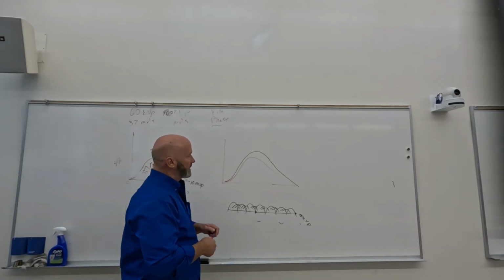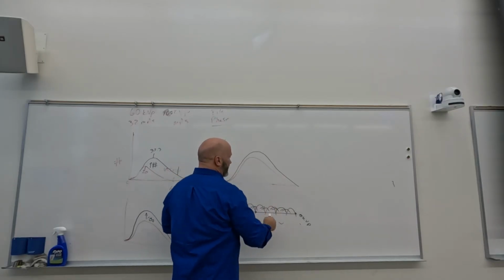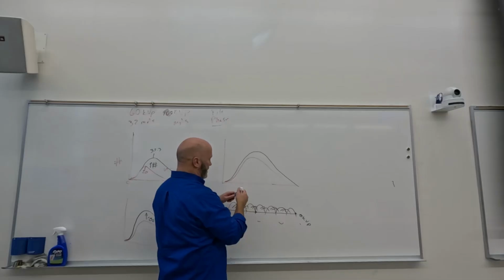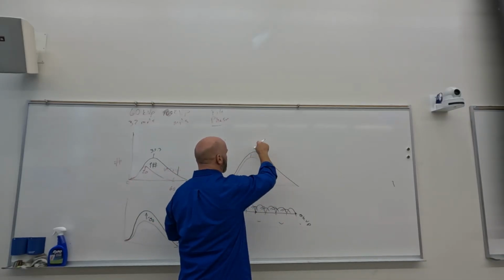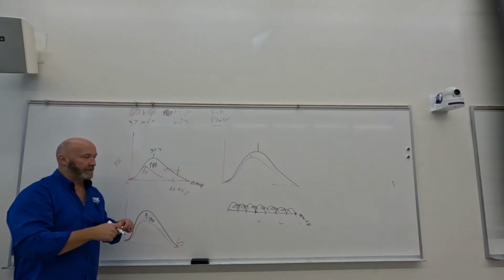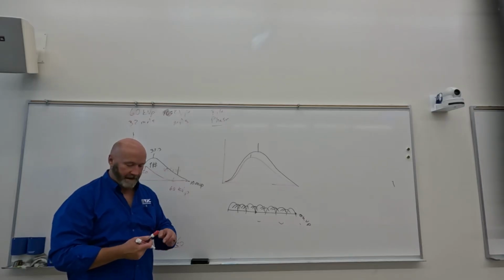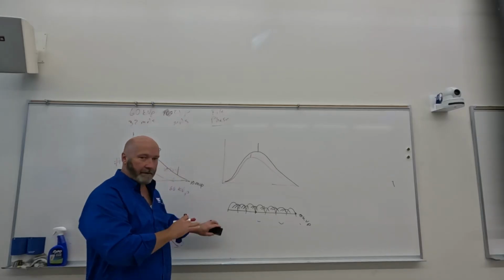And so how that translates here is that once we go from single phase to 3 phase, our peak remains the same, our minimum remains the same. We get a doubling of the numbers, but if you notice, we've got a slight change in the position of our average. So our average increases, numbers increase, so the output from the X-ray tube increases. And we've got to adjust our technique by a factor of 2. I did this the other day. Okay, everybody good with that?